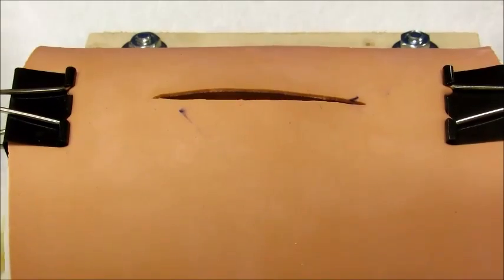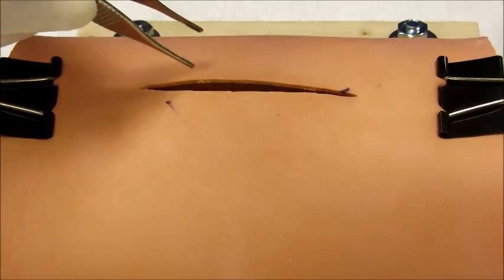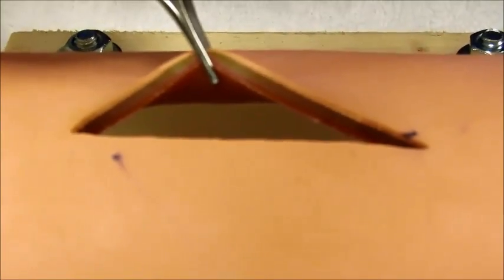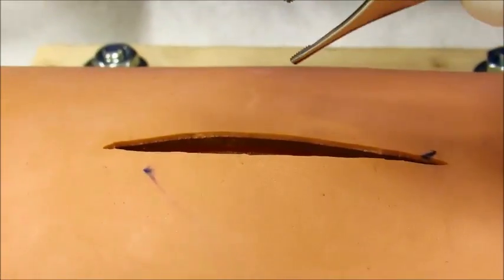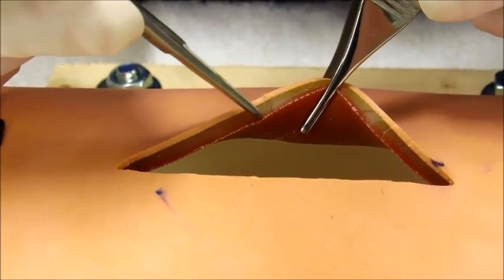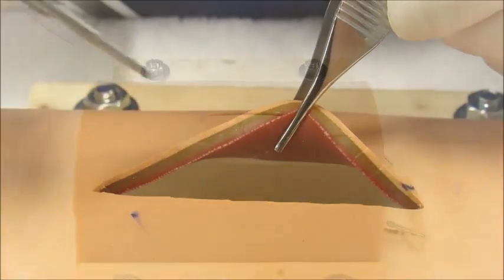So today we're going to do inverting suture patterns. We're going to use a body wall model, but we're going to pretend that it's an organ. So looking at this model, we will pretend that this layer is the mucosal layer, this layer is the submucosal layer, and then this will be the serosal layer.